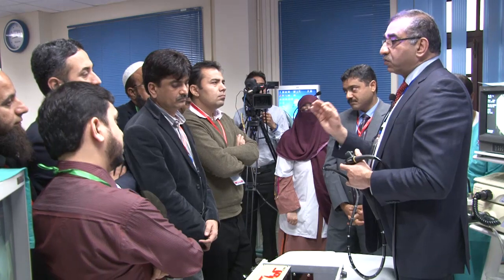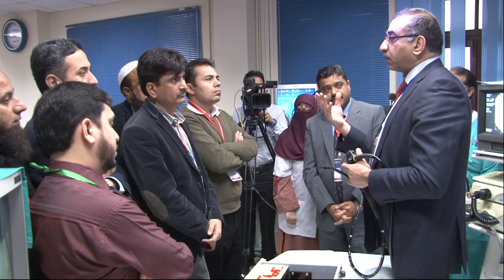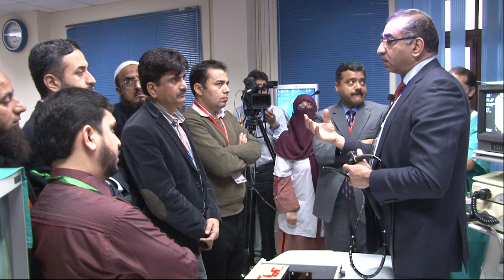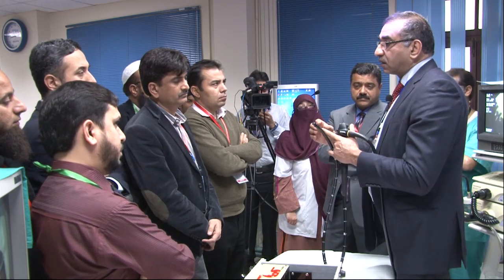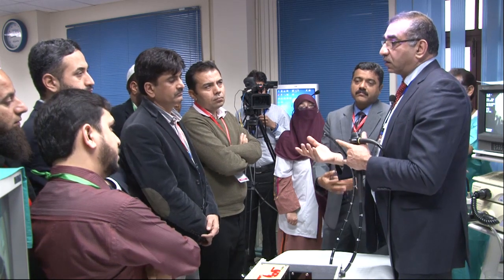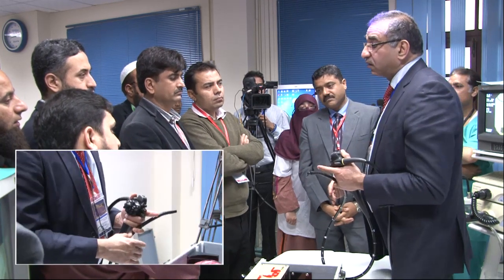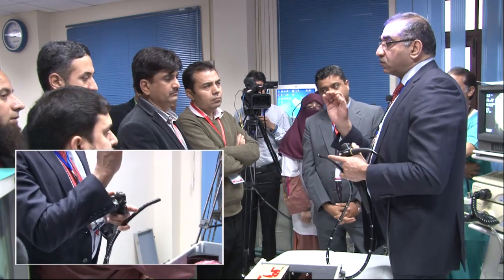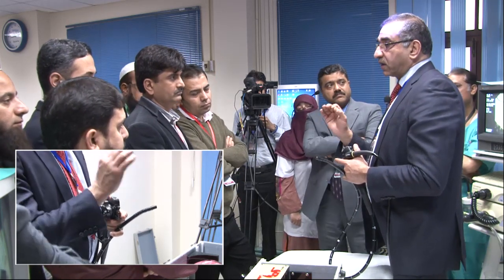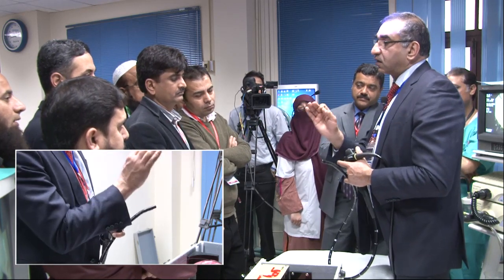Trying to probe and trying to get in from an awkward position is impossible, so forget about it. And the more you hit the papilla each time, the more difficult it becomes for you, because the papilla becomes tense and edematous, and the more edematous it becomes, the bile ducts become smaller and it becomes more difficult. When the papilla gets tense, you get tense, and it doesn't work, right? I always tell people that the first attempt is the best attempt to cannulate. So when you are about to attempt, make sure that it is the right time to do it, right?